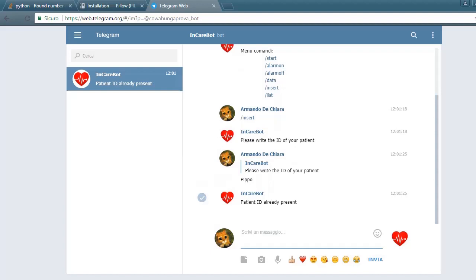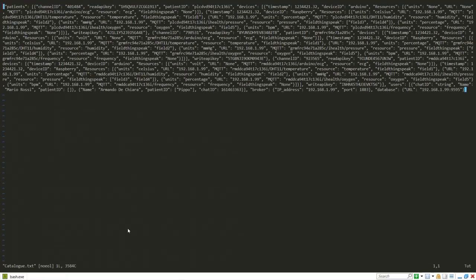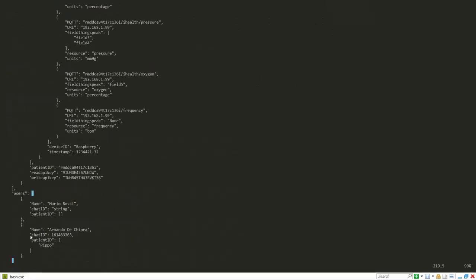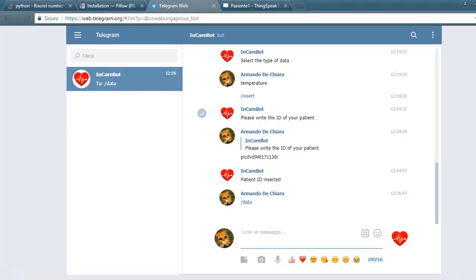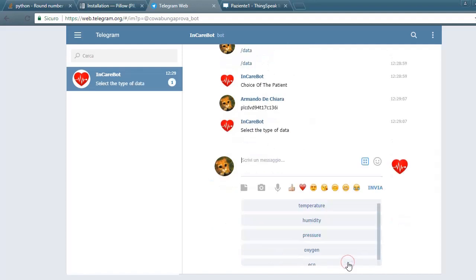Pressing the command list, we can retrieve the complete list of the doctor's patients. As we can see, now the new user is present in the catalog and also its patient Polito. The command data allows to retrieve patient's information and vital parameters from ThingSpeak. First, it shows the list of patients and the doctor can retrieve the data of each one of them. Then it shows a list of data that we can select through buttons.